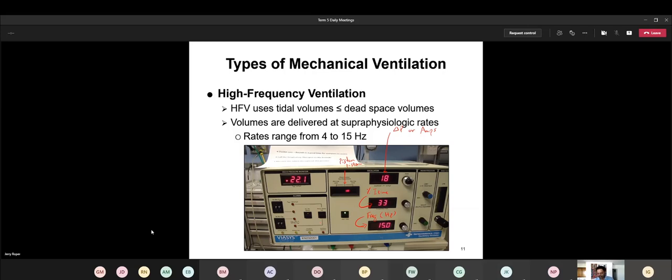And then down here, it's just some warning lights, as you see color coded. These are red, which are high priority because they're related to like your power fail, like the machine just stopped because maybe it overheated. And then these, of course, are like your alarms, like you've got a high pressure alarm set at 25 and a low at 5. Then you want to know if something happens and the pressures end up being higher than 25 or lower than 5.